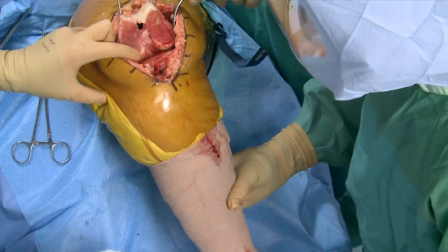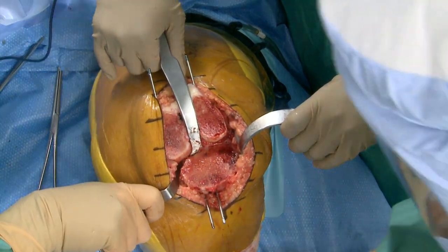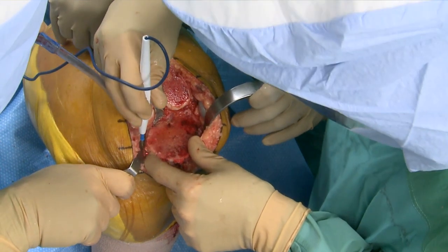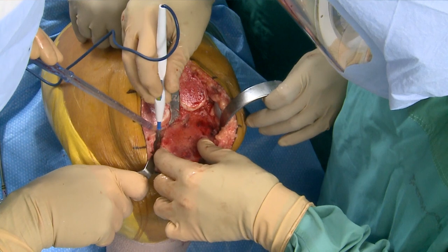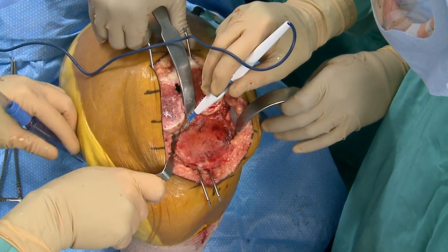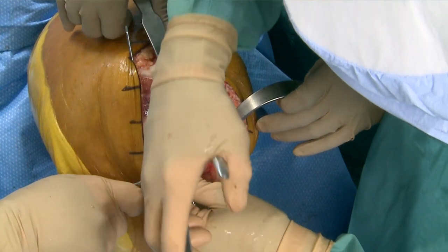I took the medial osteophytes off; my next move is to release the posterior capsule off the posteromedial tibia. We talked about this yesterday — if you're aiming to make changes in extension you want to go posterior. There's an osteophyte that overhangs and in full extension this is tenting the posterior capsule, making it tighter medially. Not only do we want to release the capsule, but then we get around the back side to remove that osteophyte as well.